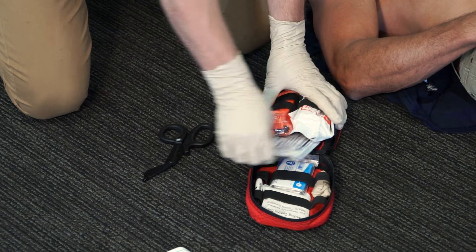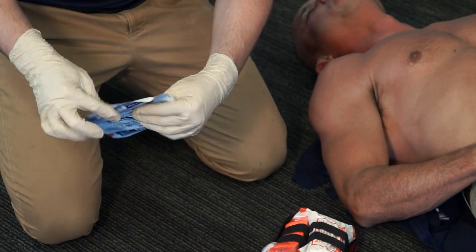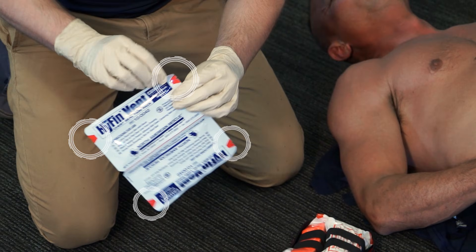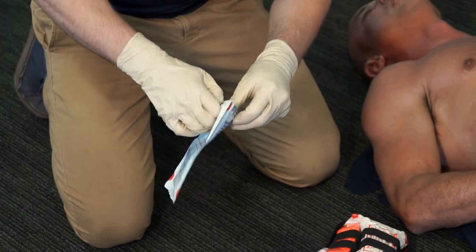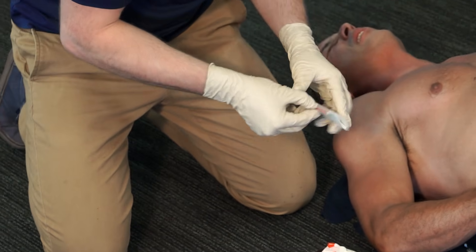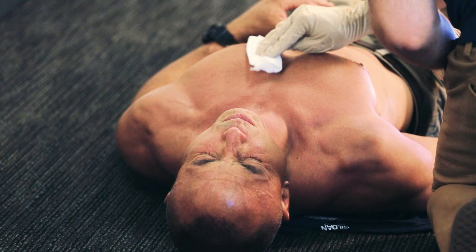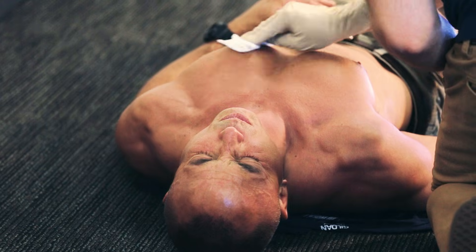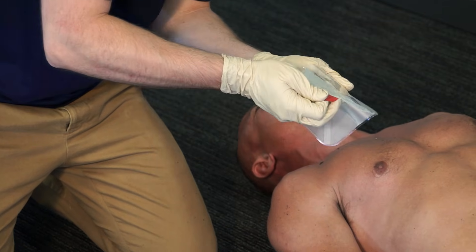Remove the Hyfin Vent Compact Chest Seal from the kit. Open the package. Use the red tabs as an indicator of where to tear. Once removed from its pouch, wipe any dirt or fluid from the skin with the gauze.